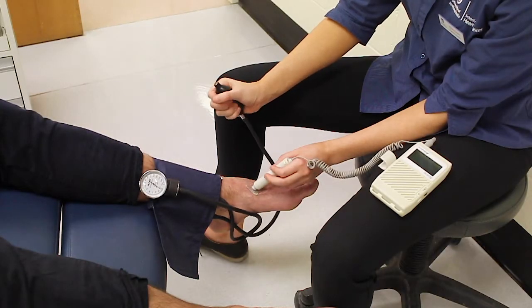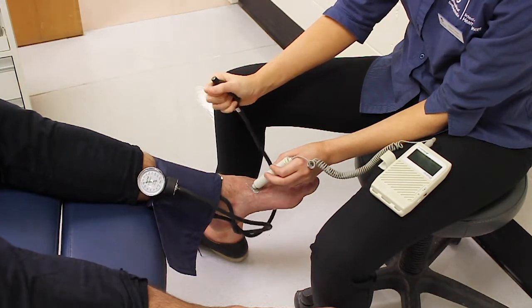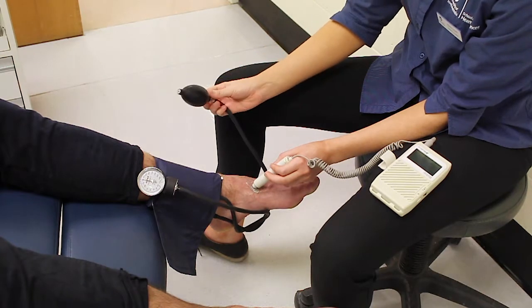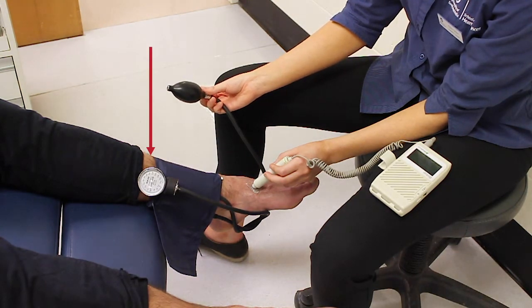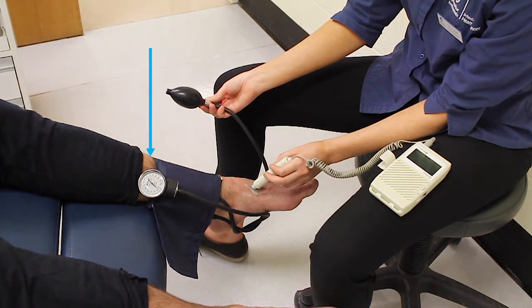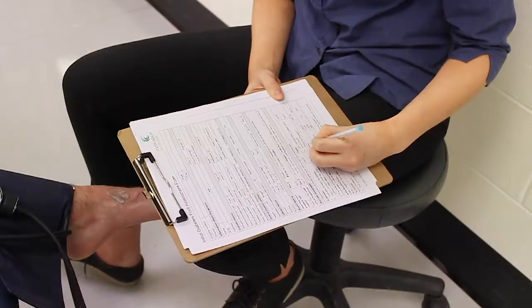When holding the Doppler in place, use the other hand to inflate the cuff until the sound of the pulse disappears. Take the pressure up another 20mm. Watch the pressure dial and release the valve to slowly deflate the cuff. Record the pressure at which the pulse sound returns — this finding is the systolic pressure. Completely release the valve and all pressure from the cuff, then record the findings.